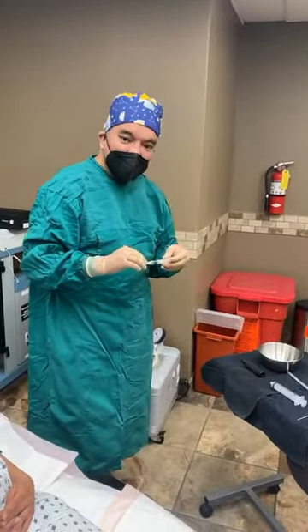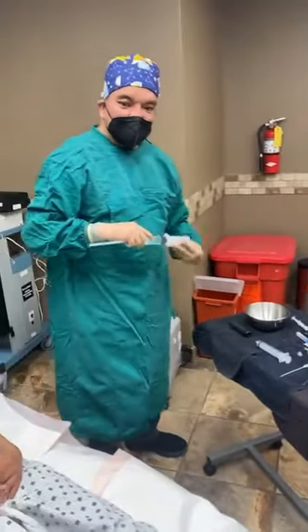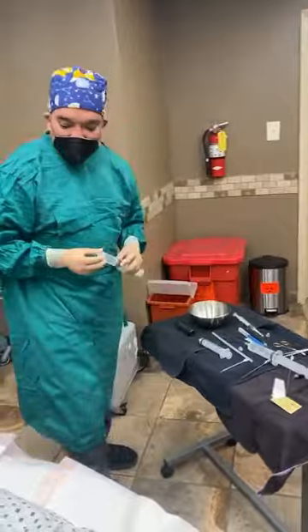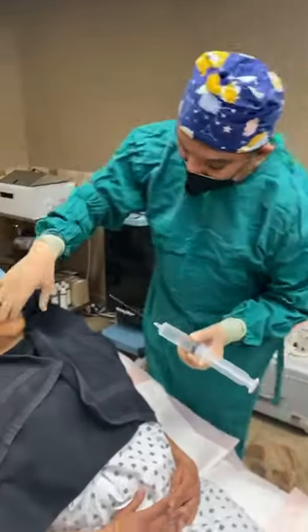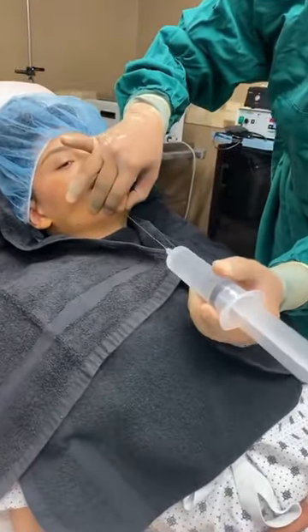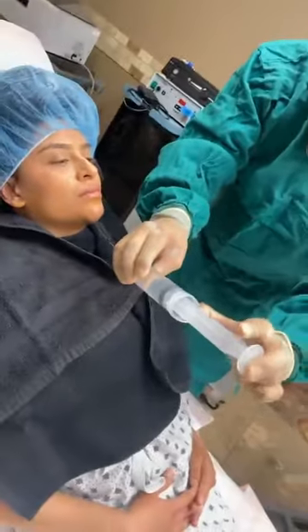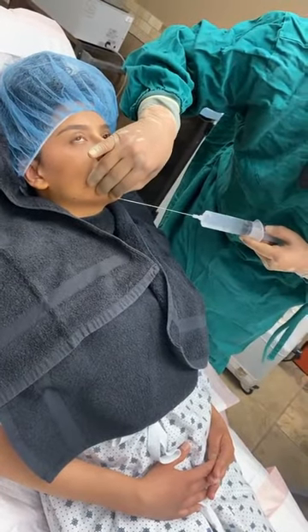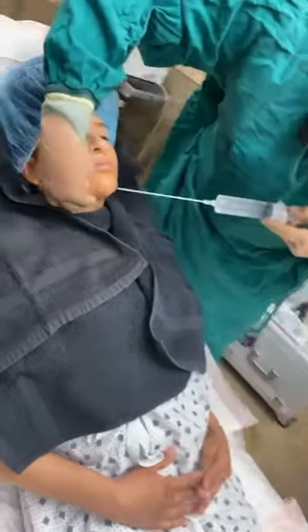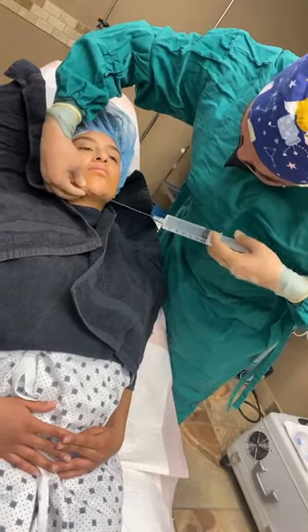All right, so as with any awake procedure, the hardest part is the numbing, because this medication does have a stinging effect when it's first injected. Now, using this big old cannula is going to allow me to enter from a single point where I'm going to numb from the chin on down. So I've already numbed the chin area, but we're just going to go ahead and do it again, this time pressing a little harder. And I'm going to numb to the chin, to the jawline. And again, I prefer to lift the tissue up when I'm doing this and inject.